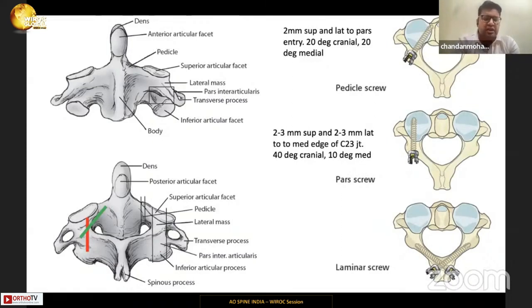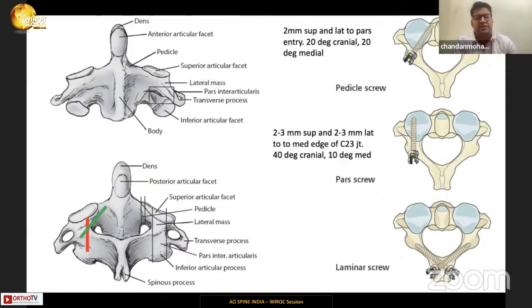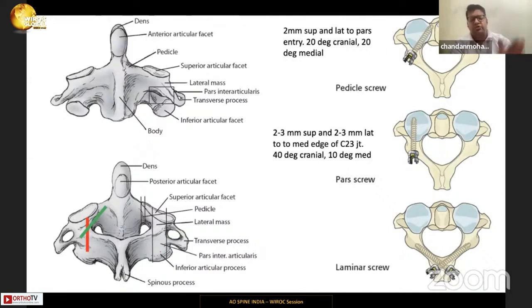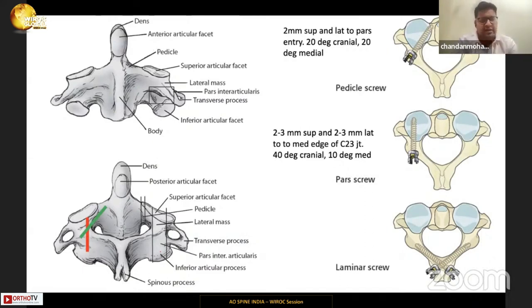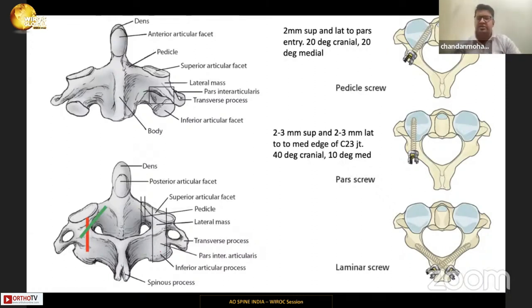On the image, the red trajectory is the usual C2 pars screw — the entry point is lower and more medial with a somewhat straight cranial trajectory. The C2 pedicle screw has a more lateral entry point to traverse the C2 pedicle safely, but the trajectory is much flatter — only about 20 degrees medial and cranial.